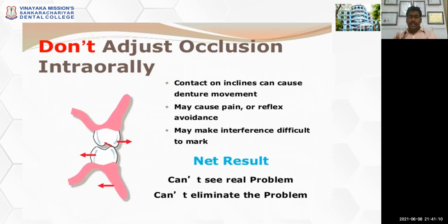Now you find that there are certain interferences when the patient is actually masticating. But how do you rectify this problem? Please do not adjust your occlusion intraorally. There is something called remounting.